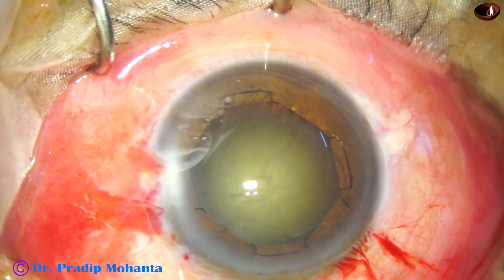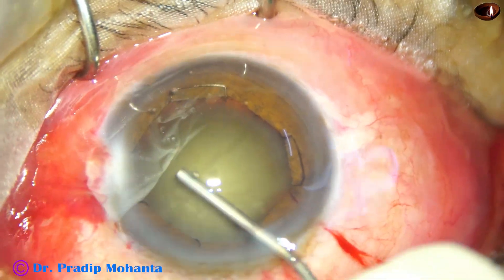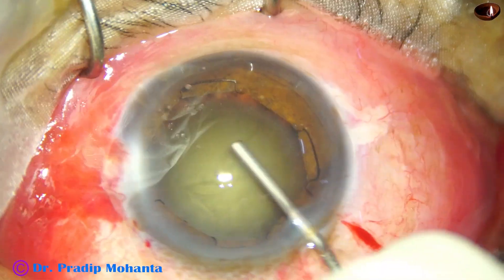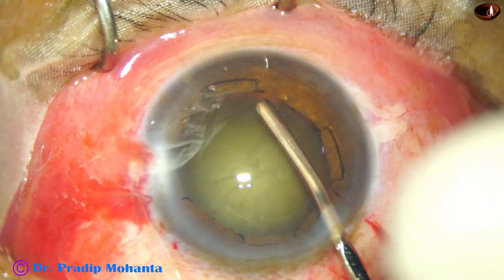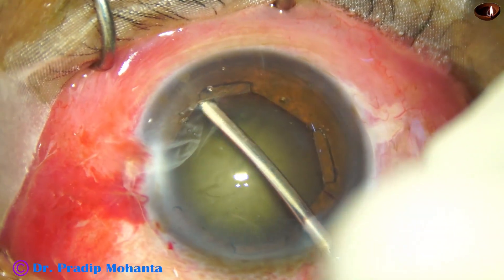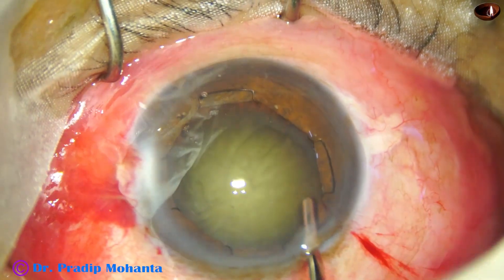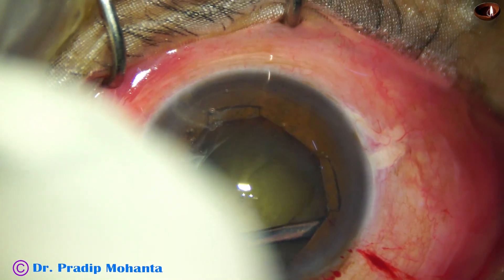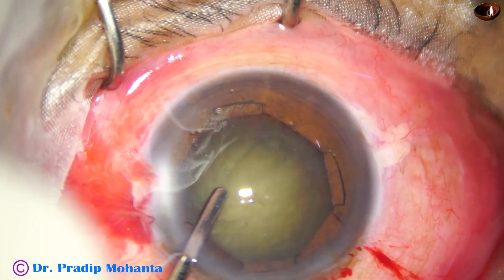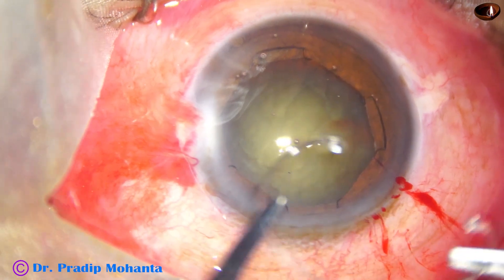Now the viscoelastic substance is there, and the pupil has taken a beautiful octagonal shape. What I am doing now is hydro-free dissection before applying the capsular tension ring — using an iris spatula. The reason I do hydro-free dissection instead of hydro-dissection is because if I do hydro-dissection, the cortex comes out, gets hydrated, and visibility becomes poor.